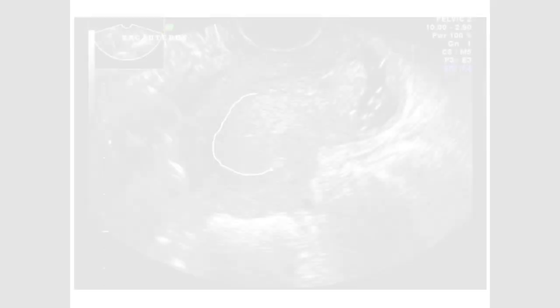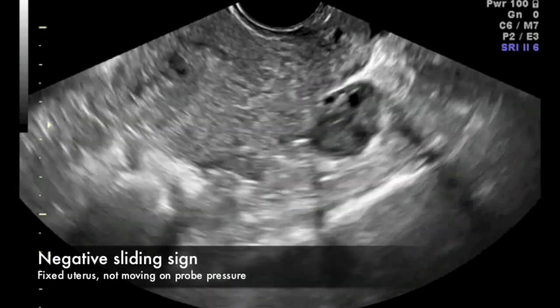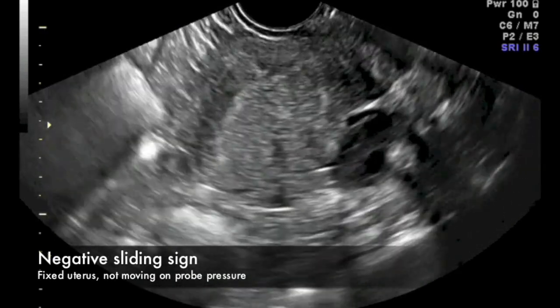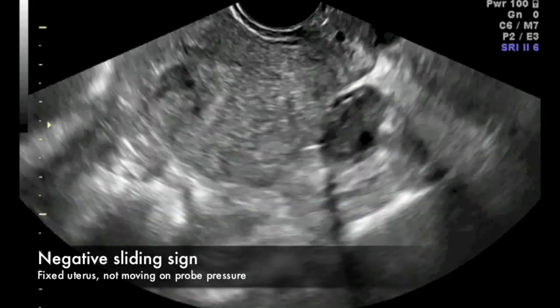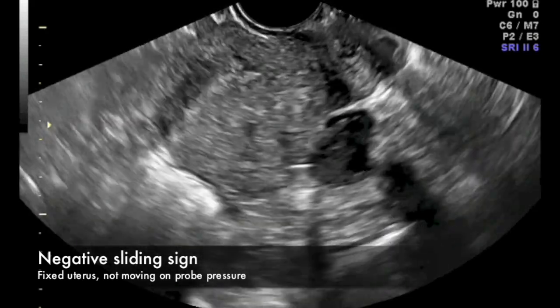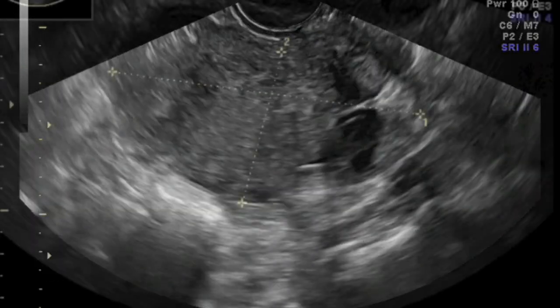In this section, we will review some of the markers of endometriosis on ultrasound. Here we see an acutely retroflexed uterus that can be a sign of underlying adhesions. Inability to slide the uterus over the anterior as well as posterior peritoneum demonstrates a negative sliding sign. This again suggests adhesions due to underlying endometriosis causing obliteration of the cul-de-sac posteriorly and vesicouterine recess anteriorly.